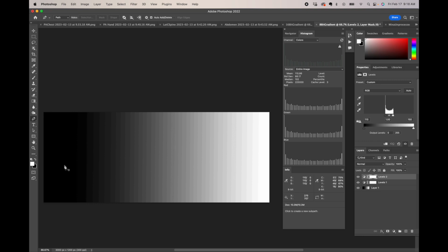The reason it's doing that is it's applying what he called the lookup table, where it's automatically taking the raw data that's been collected and adjusting the tonal values to give what it knows to be a technically correct image. But when it does that, it's causing combing type issues with the histogram.